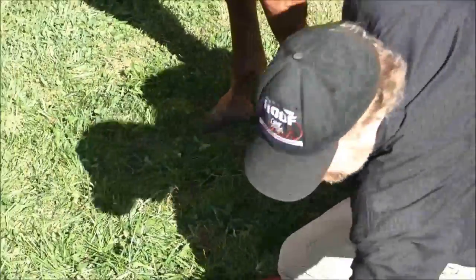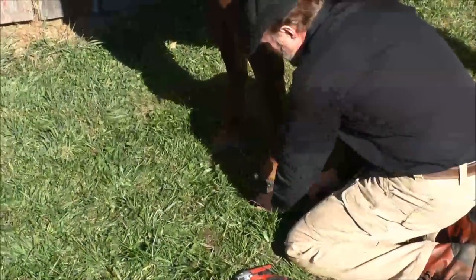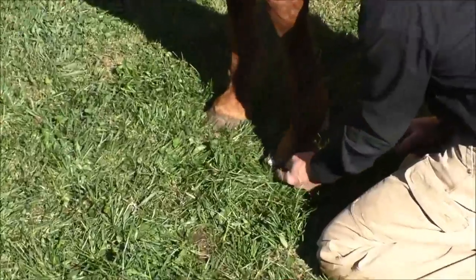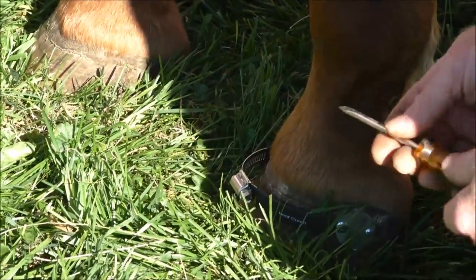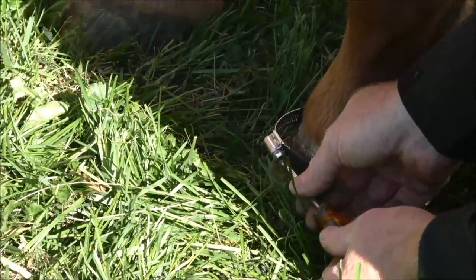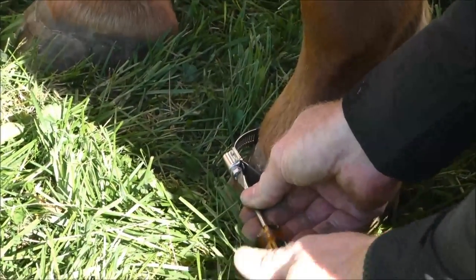Once you have the band on, you'll notice that it can pivot up and down. We want to get one inch below the coronary band, down on the hoof wall. That puts us just below the extensor process on the coffin bone, unless you have a sinker.